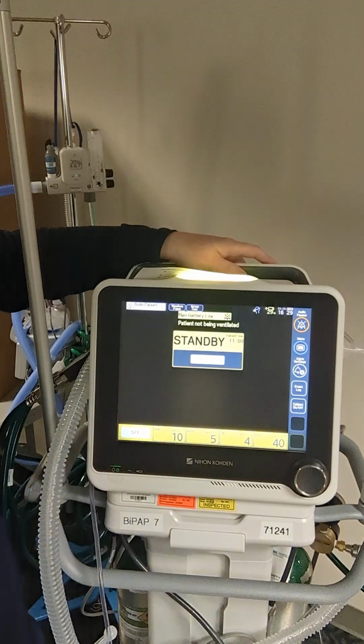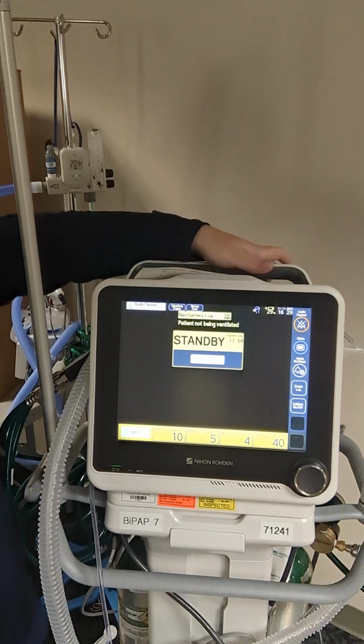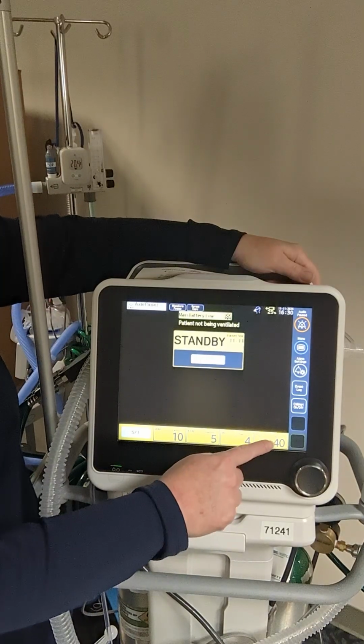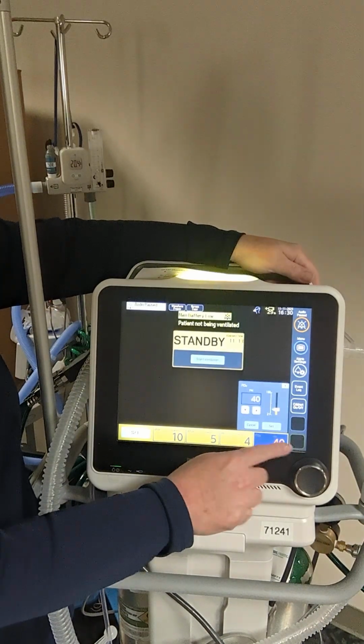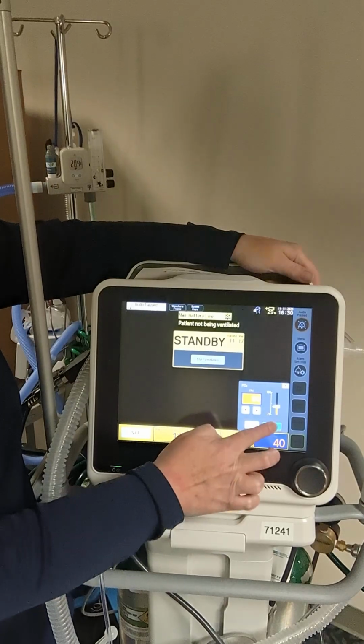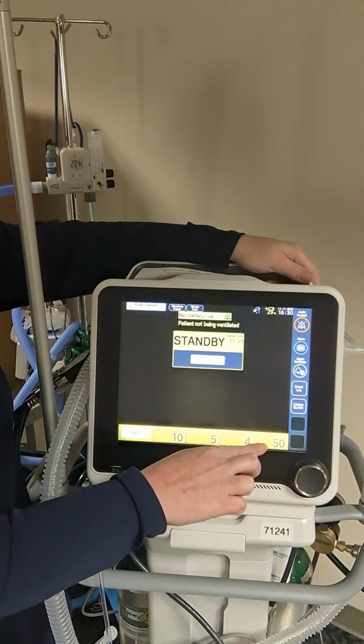So FiO2, again, on any of the things that we're using, nurses are able to adjust the oxygen concentration to achieve our saturations on the monitor. So to change the FiO2, tap, turn, tap. And that's going to change our overall FiO2.